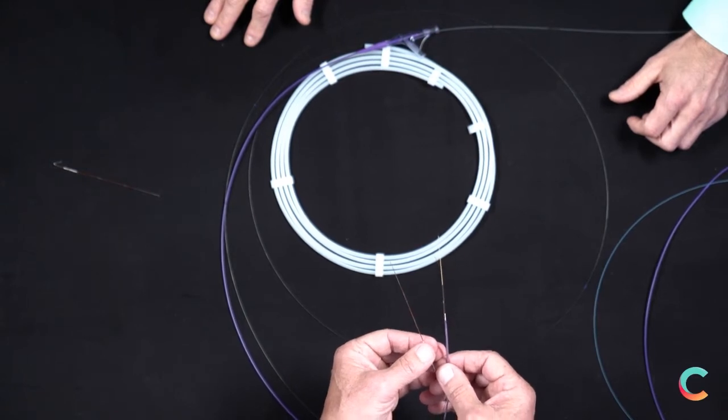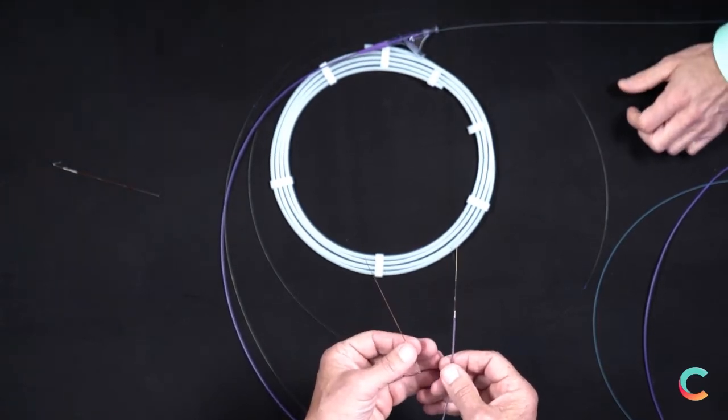The customization of things, you being able to expand your skills. What comes to mind when you see this? Well, I see it as multiple applications for that adapter. So now I can take a balloon catheter that has one usage, inflate a balloon, and add an adapter to it, which could be multiple. I could add an imaging section, a scoring section, a blood clot removal section, or a catheter tip section, which would decrease the number of times I have to take a device in and out of the body.